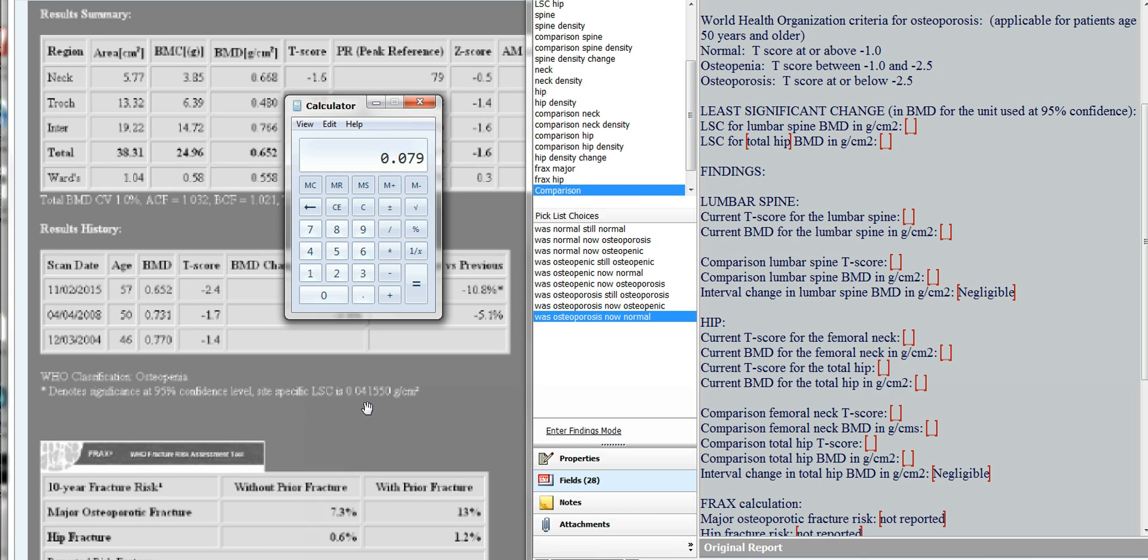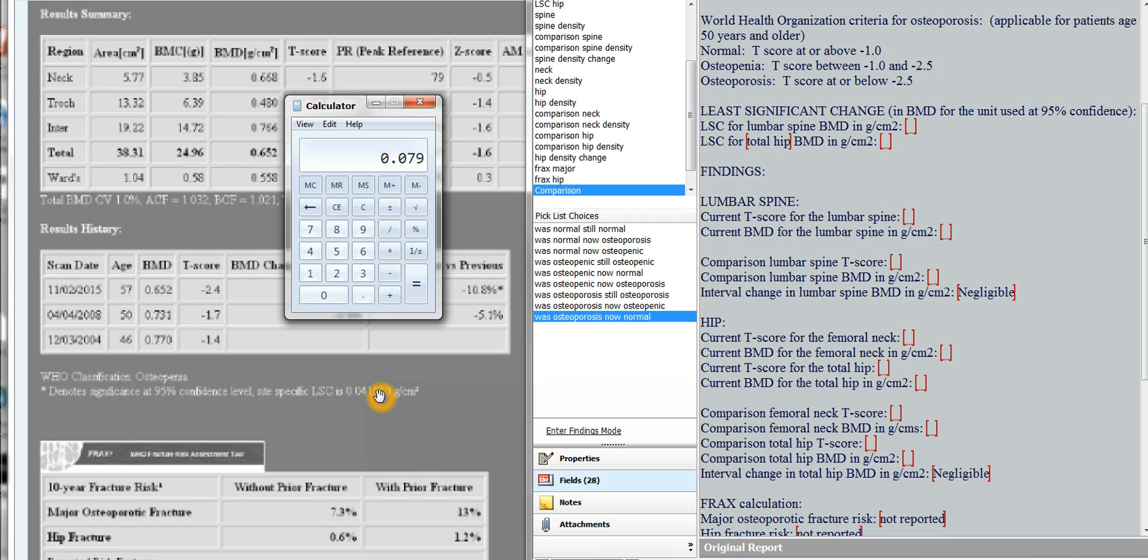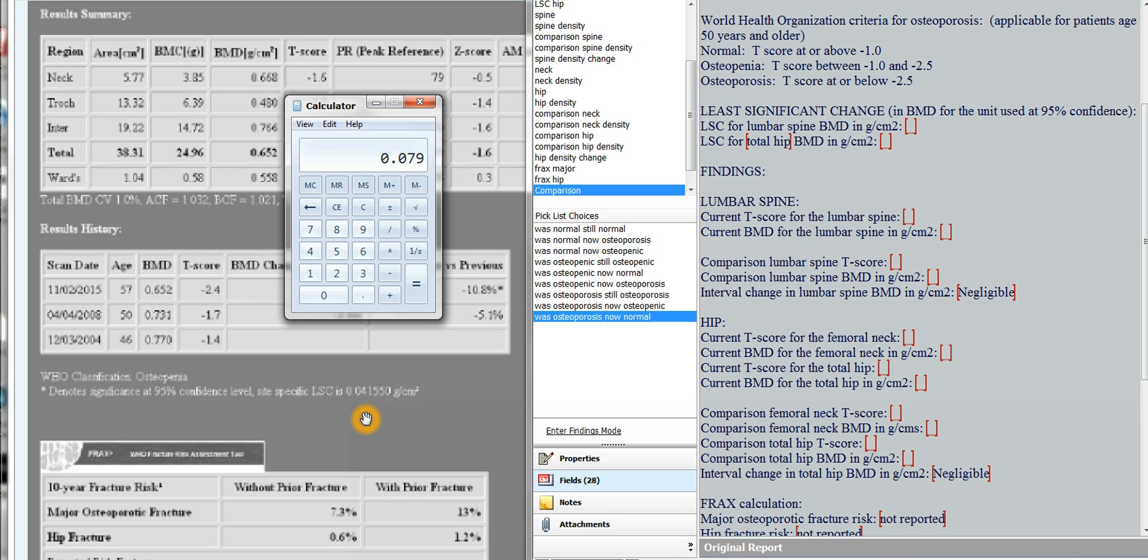Now you never use the wrist for measuring interval change. And another thing is that the Hologic always uses total hip and spine, but the GE Lunar, at least the one we have, uses femoral neck instead of total hip for the comparisons. And everything else is very similar. All right, so that's how you determine and report the statistically significant change. And you try to use the lumbar spine, it tends to be the most reliable, so you default to using that and reporting that.